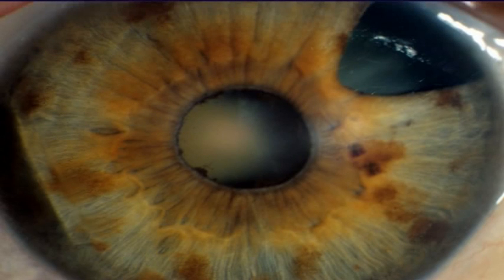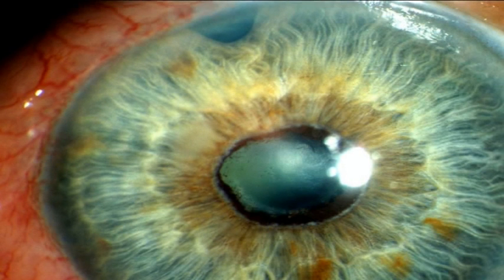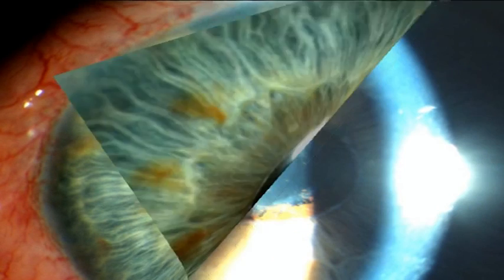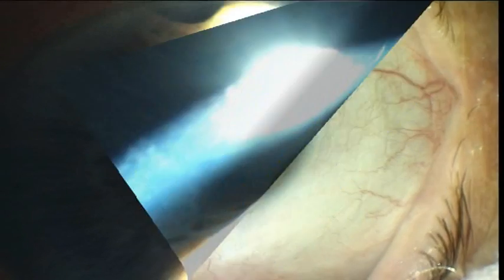In spite of several recent innovations in cataract surgery, the manipulation of the small pupil can present some problems. Poor visualization and additional manipulation increases the risk of complications during and after the operation.